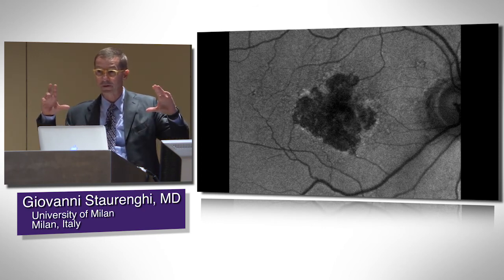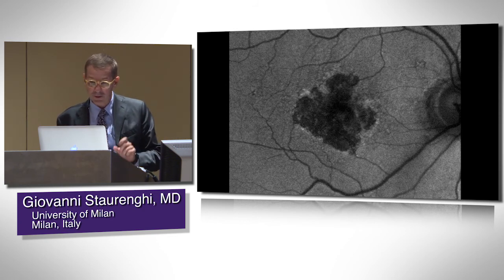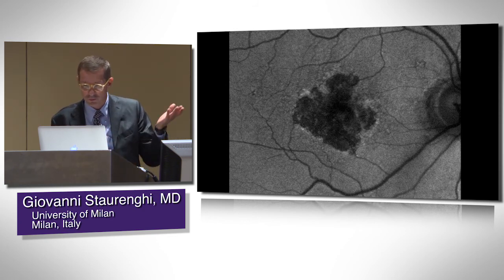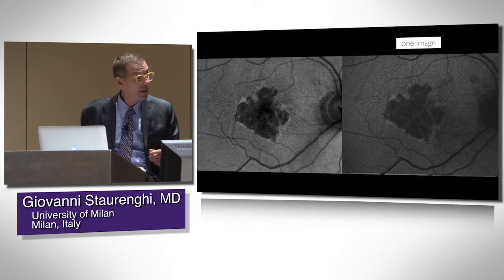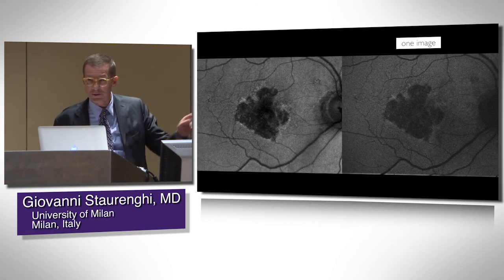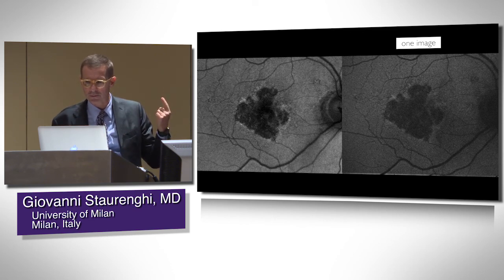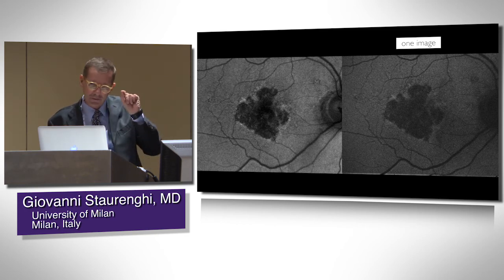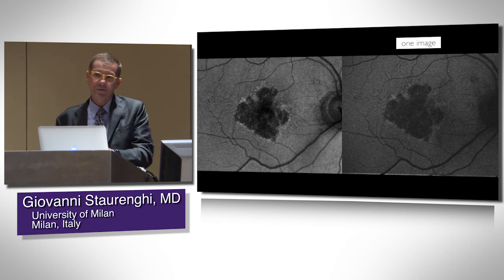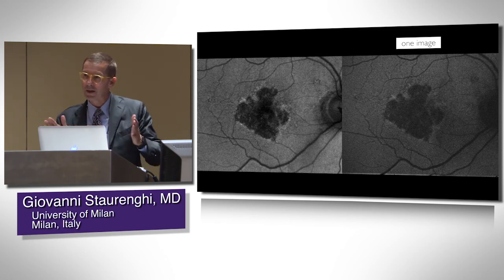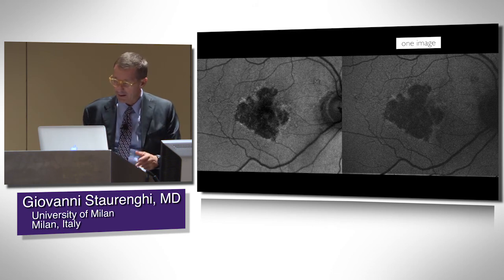This is the same patient taken with the Heidelberg — that image is a mean of multiple frames. Here is the same patient with the Adon. But what if we take a single image from the Heidelberg? You can see that because it's more confocal, you lose light. So you need to average a series of images to get a decent image quality.